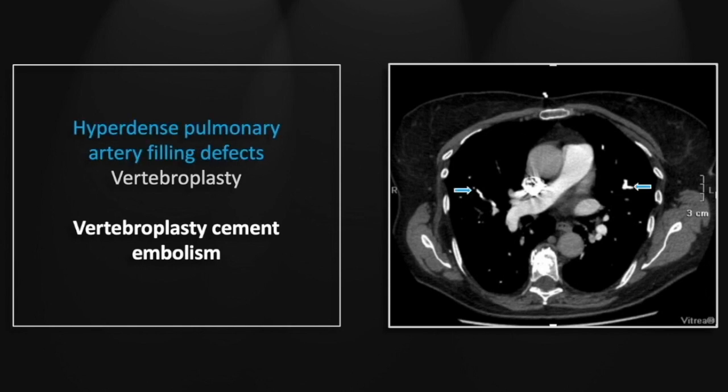There are linear branching densities throughout both lungs in a pulmonary vascular distribution, and there is vertebroplasty cement with an extravertebral linear contrast density denoting the venous entry point for this contrast.